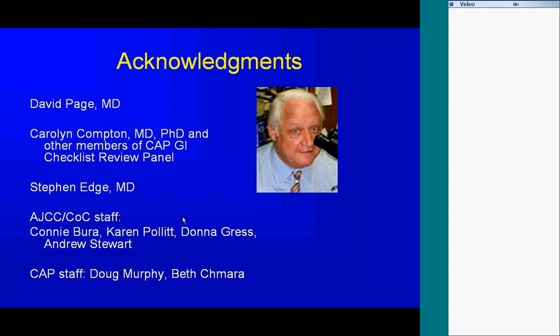Okay, here's a question from Ottawa Hospital. In rectal cancer post-neoadjuvant therapy, the number of lymph nodes is usually 6 to 8. Do we still need to find 12? The answer to that is no. And if you're defining 6 to 8 after neoadjuvant therapy, I think you're doing a good job. And one way I assess how well our residents are doing is the size of the lymph nodes found. If they're finding nodes in the 1 to 2 millimeter category, then I feel much better about them.